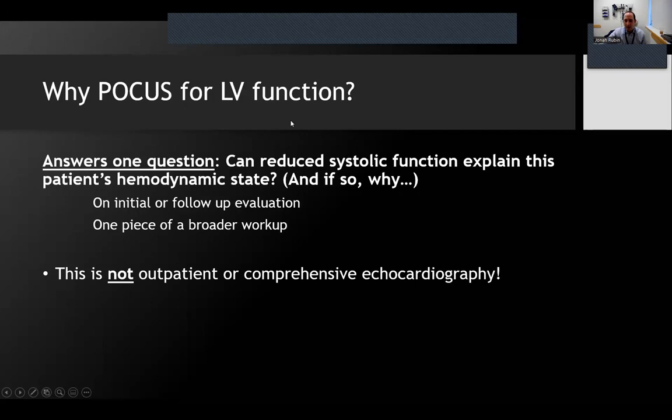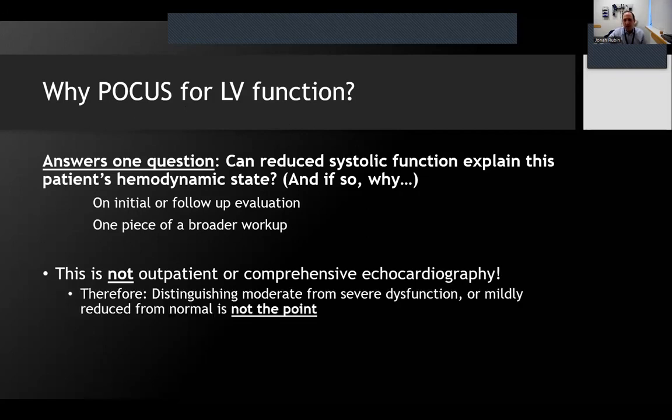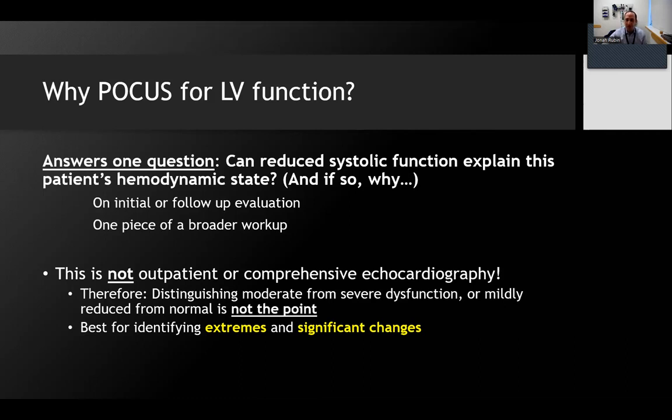And it's not an outpatient or comprehensive Echo. And to that end, it's not as important for you to be able to distinguish moderate from severe dysfunction or mildly reduced from normal. And we'll get into that a little bit later. It's most helpful for identifying extremes and significant changes. And the difference between the extremes that you might be able to identify and the changes you might be able to pick up will improve as you refine your approach to assessing LV function.